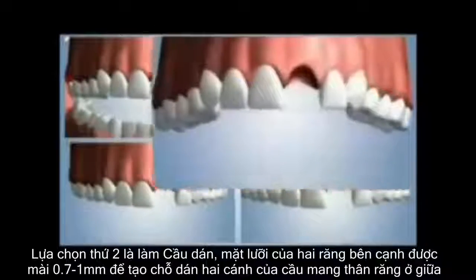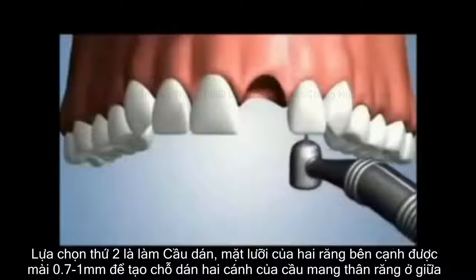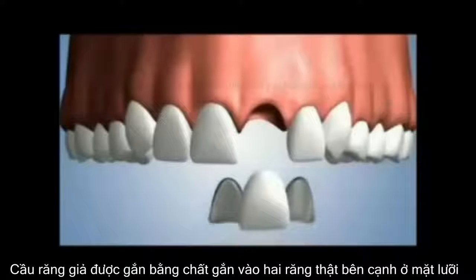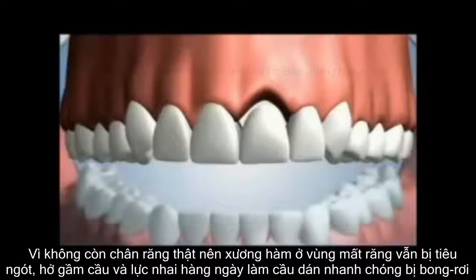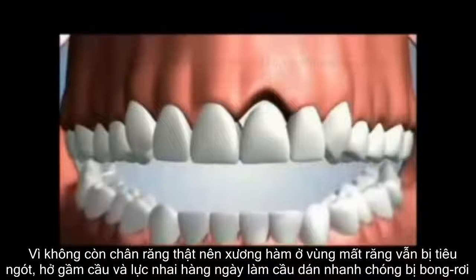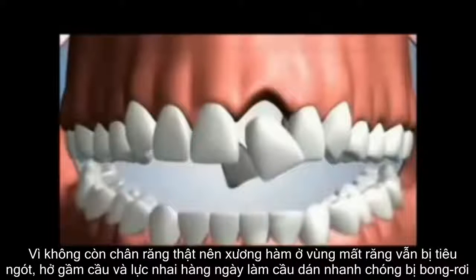In a second option, known as a resin-bonded bridge, a high-speed drill is used to cut into the back of the neighboring teeth. A prosthesis is then added to the back of your natural teeth. With the absence of the natural tooth root, the bone above the crown begins to shrink. Everyday biting forces will also begin to apply opposing pressures that will loosen the bond over time.